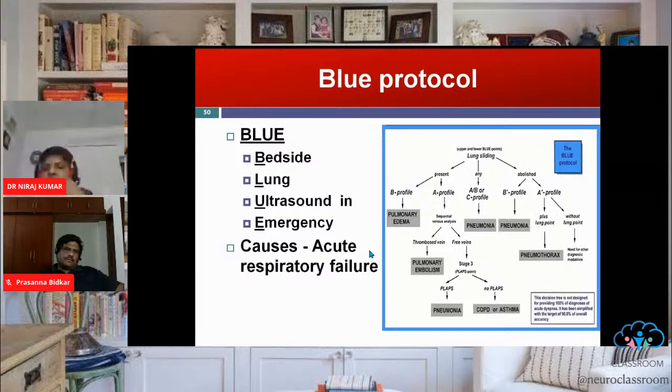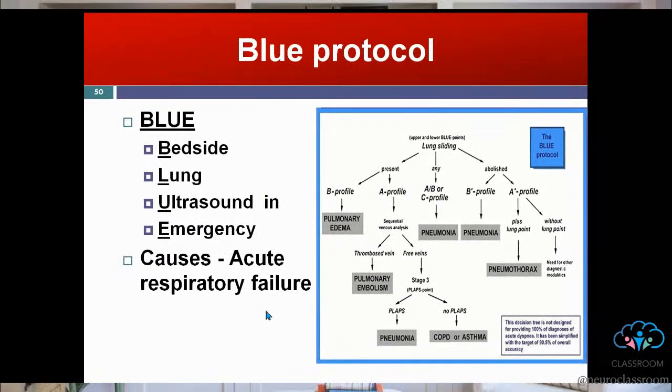So now we come to the BLUE protocol, which is very famous, described by Lichtenstein. He's the pioneer in the field of lung ultrasound, and he described this BLUE protocol, called bedside lung ultrasound in emergency. This protocol is used to find out the cause of acute respiratory failure in an emergency. The BLUE protocol described by Lichtenstein is a stepwise approach.